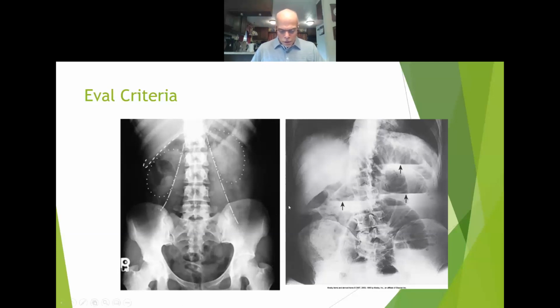Position of patient. With the patient in the upright position, place the anterior abdominal surface in contact with the vertical grid, abdominal midline to the midline of the IR. When you're shooting PA, you're going to run your finger straight down and find those spinous processes. If you're doing it AP, your MSP, you can find the xiphoid tip, the little bony part right at the bottom of your sternum, and use that as your guide to find the MSP of the patient from the anterior.